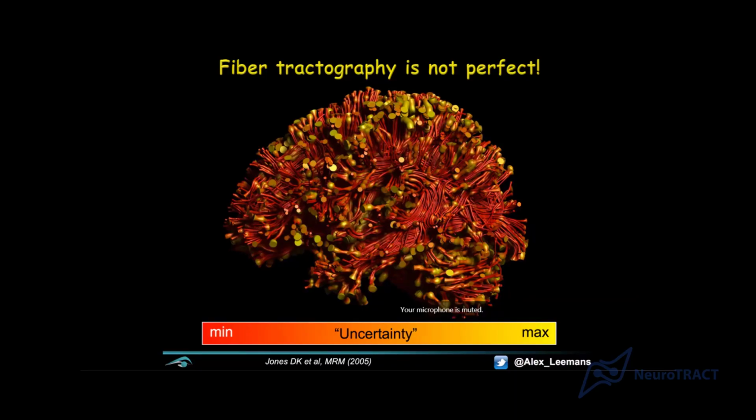Okay, so again, what I'm showing you now is the uncertainty associated based on noise. So if you were to repeat the experiment again and again, there are some spots that show a higher uncertainty, right? And this is mostly related to the model itself, not necessarily to the noise, because then you would assume that this uncertainty would be the same across the different locations. But the uncertainty is also associated with the model itself.